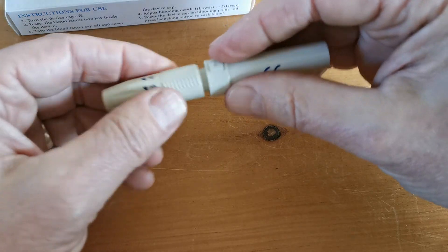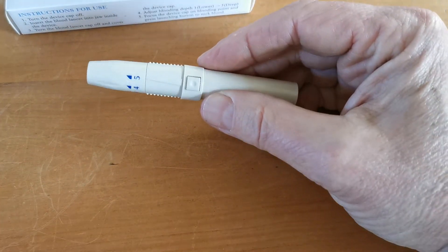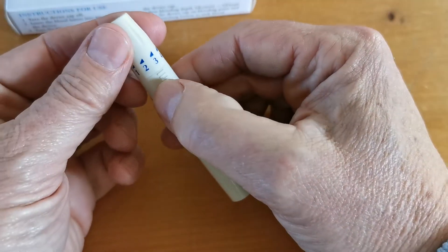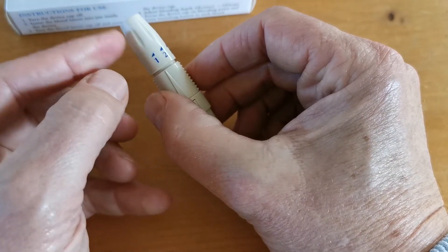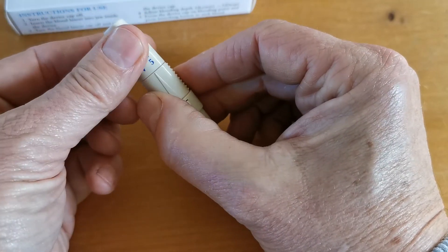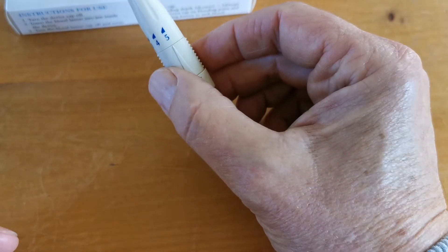The lancet is then reinserted into the lancing device, and on the eFast you've got one of five depth settings, which you'll see here on the side. This is a rotating aspect — as you rotate it to the very superficial setting, the cover moves away from the base, and as you move it round to five, that is the deepest of the settings.